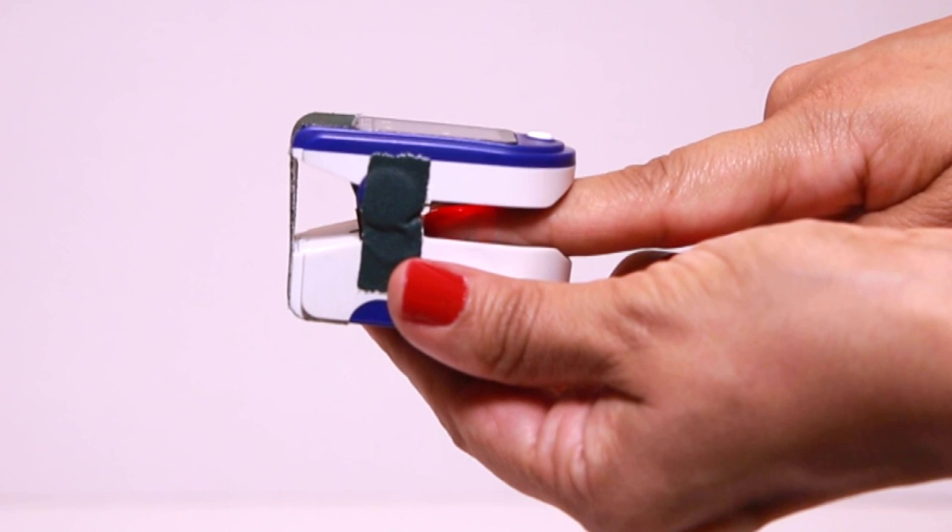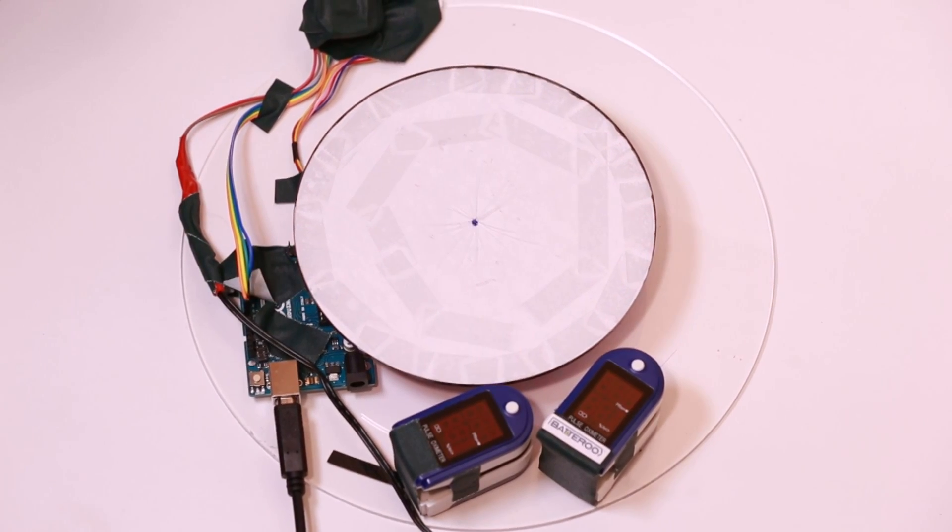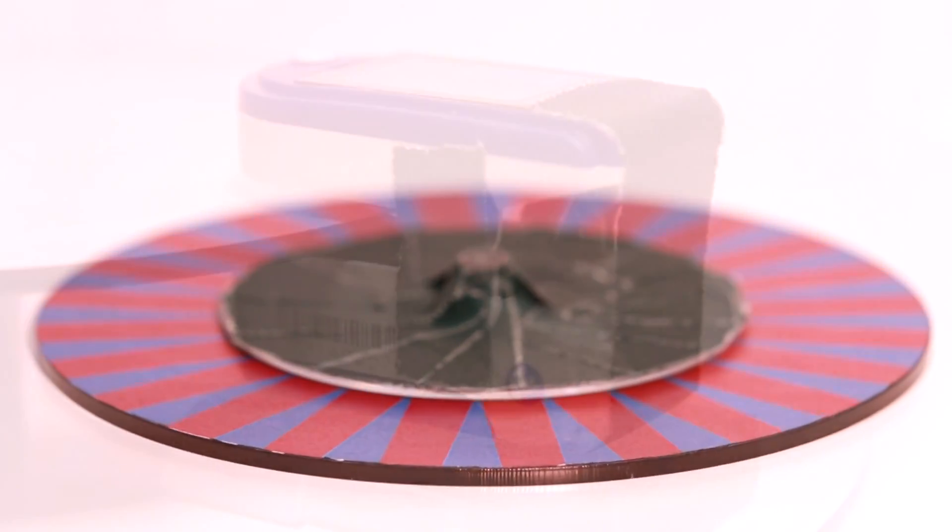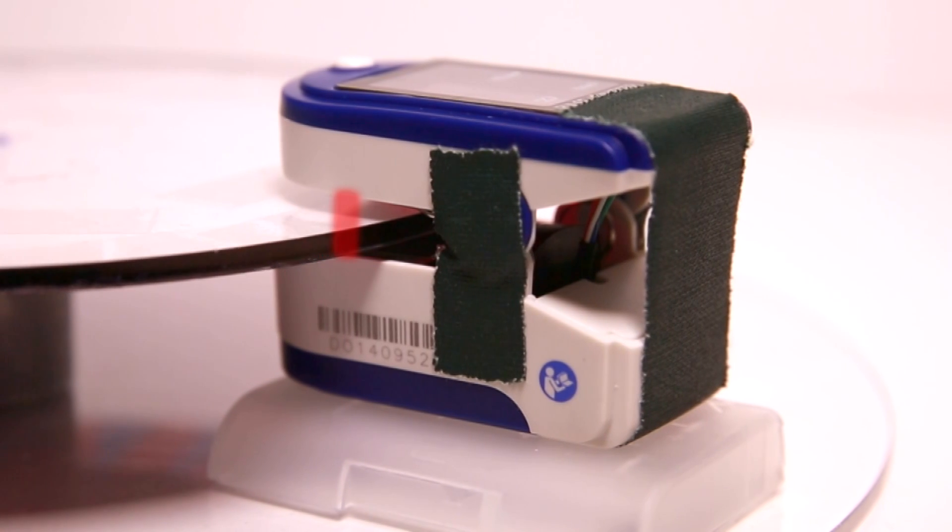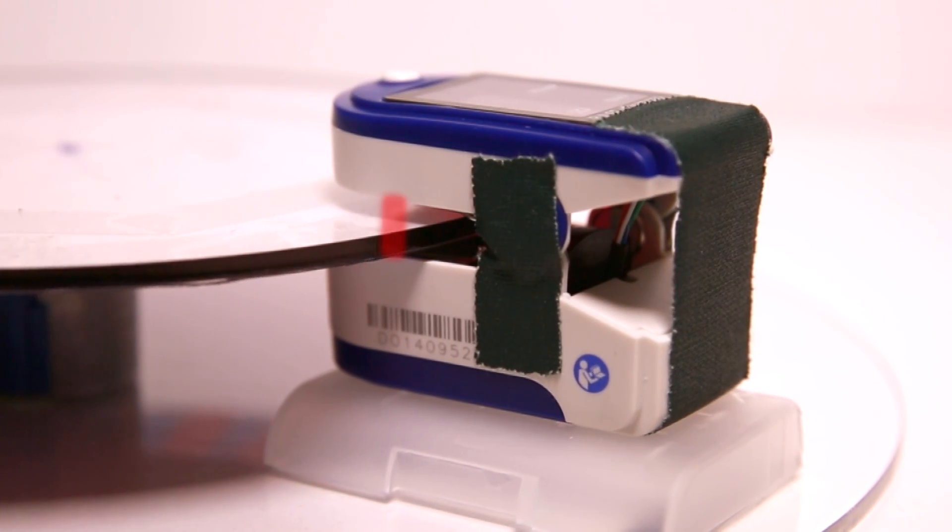It functions by shining a light through the finger to make the measurements. For this experiment, we have devised a spinning device that reflects different light patterns. When read by a pulse oximeter, this setup mimics light patterns similar to those of a human finger.